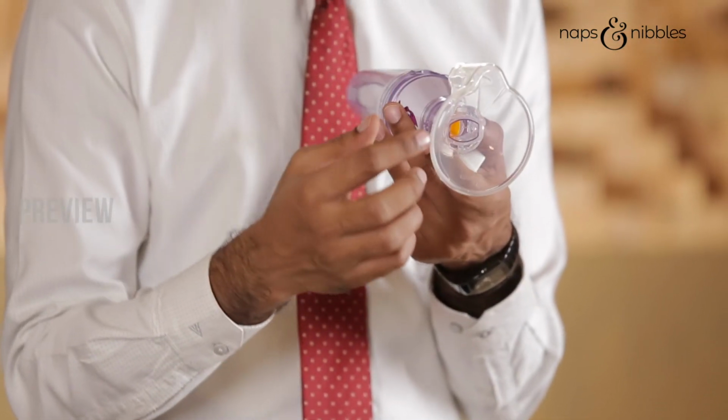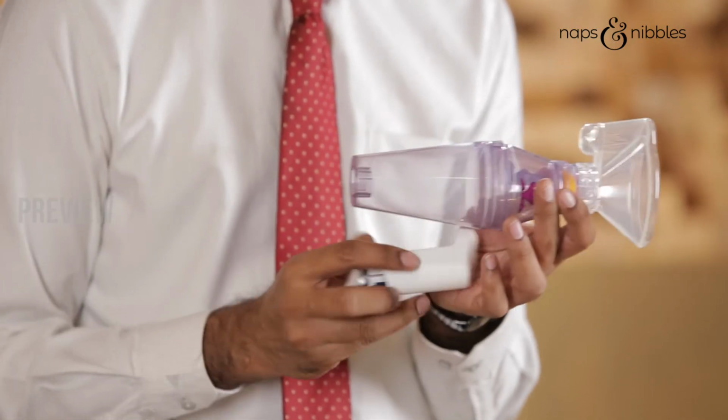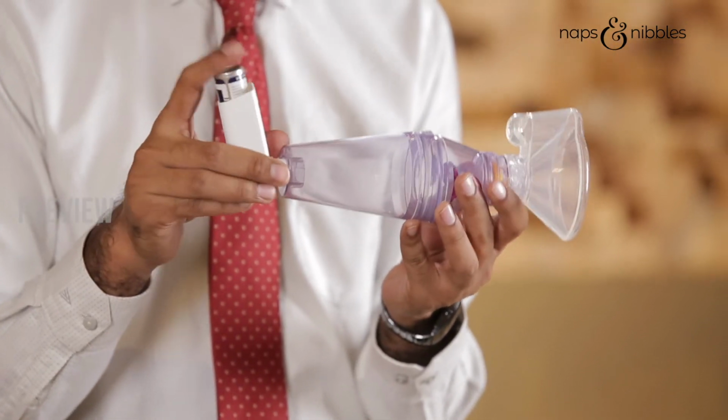So in this case, you need to ensure that the mask is fitting correctly and with a tight seal around the child's face. There should be no leak around this mask. You can then administer the puff in the same way as I described before. Except here, a child less than 4 years may not cooperate to take the deep breaths, hold his breath, or even have the patience to listen to any steps.